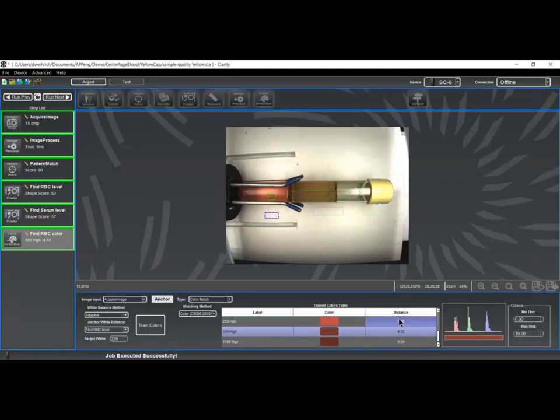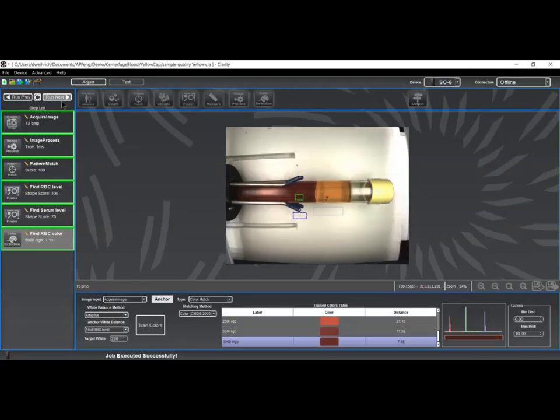This index along the side here is what's known as a color distance. It's computed by this CIEDE methodology. It shows that, as you might expect, this color, if you visually look at it, is very close to this color, also very close to this color, which is kind of indicated by the numbers here being very close numbers. And in some cases, the color distance is quite a large number. These color distance numbers can be output as well to give you a confidence level of how close you are to matching your reference colors that are stored.